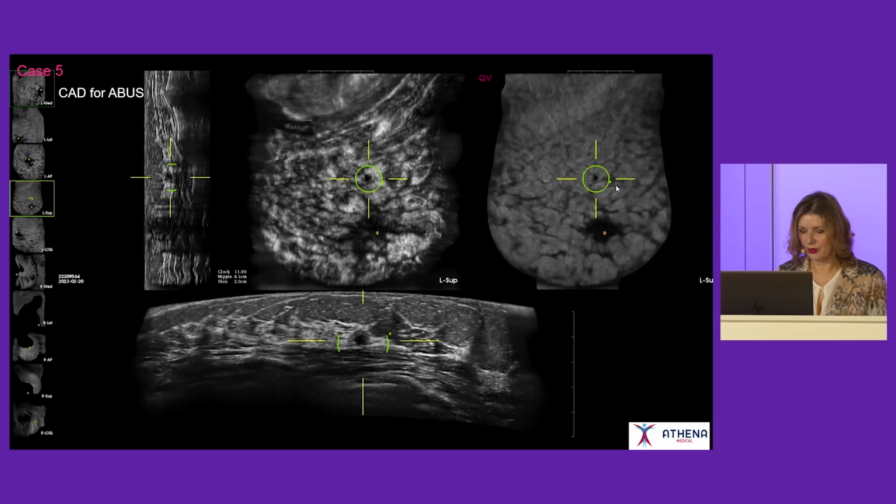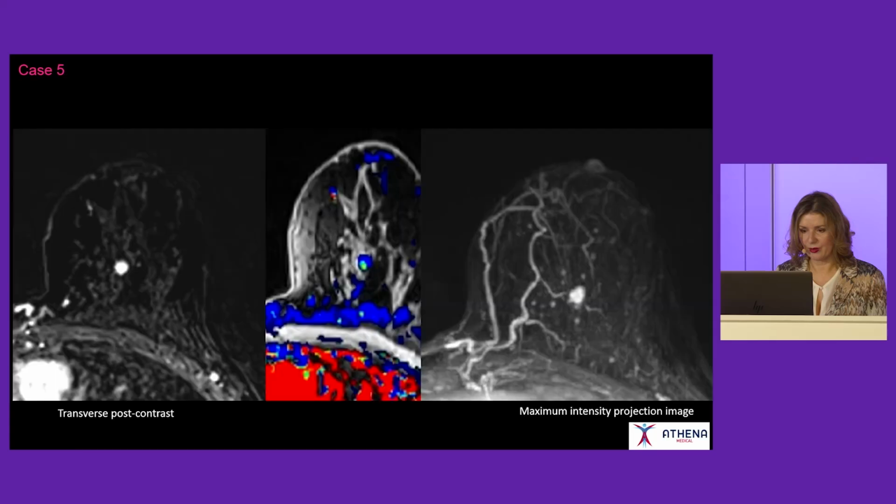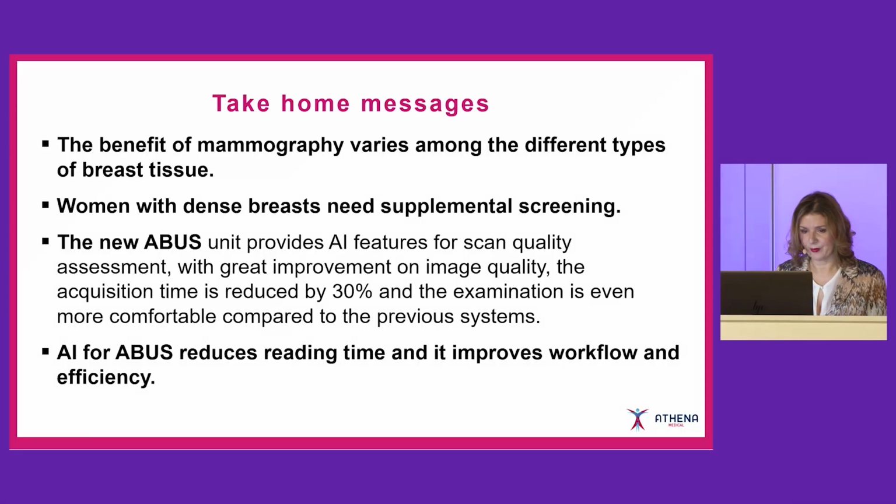up here. And these are the correlates of handheld breast ultrasound, her MRI exam, and this was a tiny 0.6 centimeter invasive ductal carcinoma.